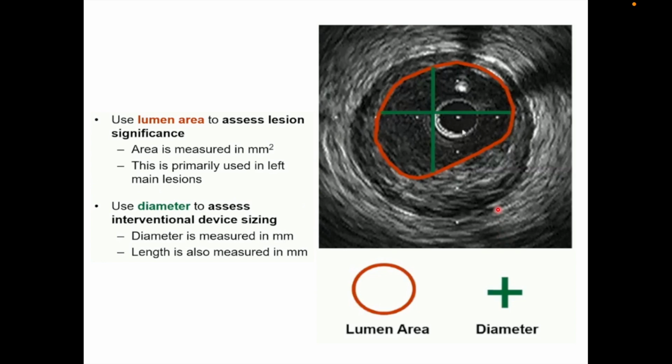A quick reminder of the anatomy. That's the adventitial layer. Then in between is this black line, which is the layer of media. That's the smooth muscle. And then inside the smooth muscle, you can see there is this plaque. That's the intimal layer which contains this plaque. This is eccentric plaque because it's more on one side as compared to the other side. And then if you line with this red marker, it's lining the intima from the inside.